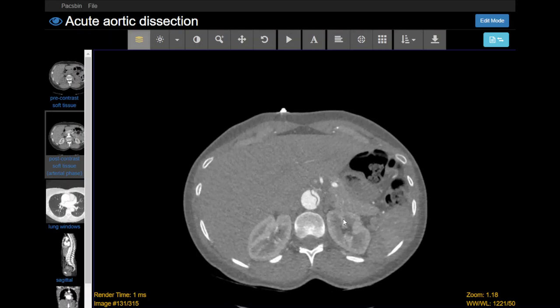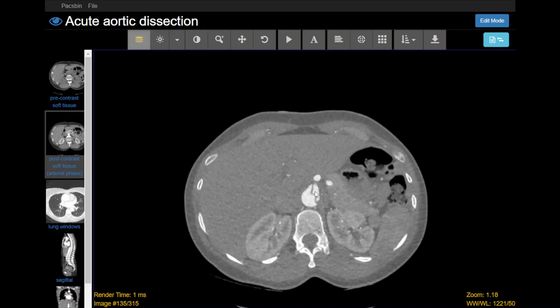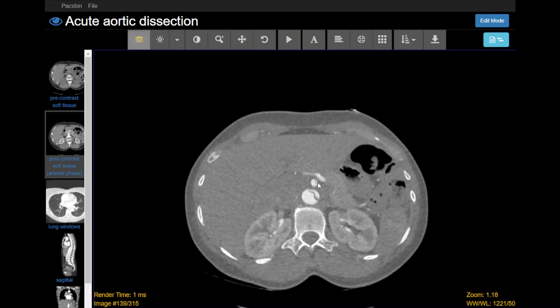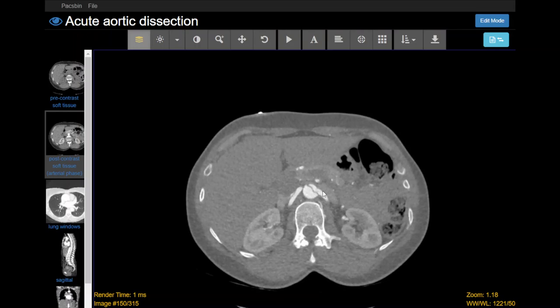Continuing to follow the aorta into the abdomen, the first branch is the celiac trunk — the most superior one. You can see it's coming off the relatively small true lumen, and the flap does not extend into the celiac trunk itself. The next vessel coming off anteriorly is the superior mesenteric artery, which is one of your important arteries supplying the bowel, and you can see that the flap extends into this artery — even here you can see a small part of the flap. The right renal artery is coming off the false lumen, and the left is coming off the true lumen.